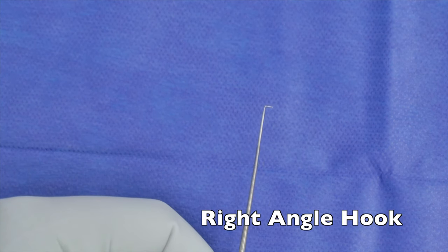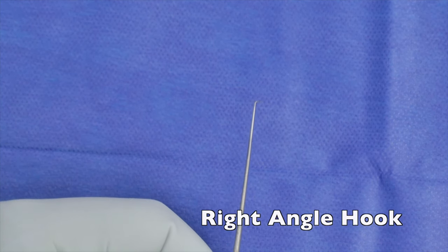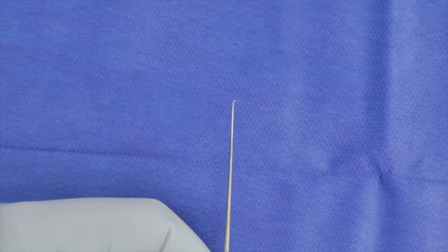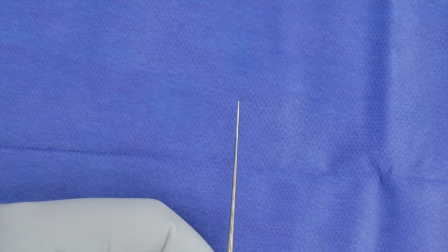Then we'll get into our right angles. There are many different sizes you can have for right-angle hooks: a 3mm, a 1.5mm, a 1mm, a 0.5mm, a 0.3mm. As you can see here, it's just what it says — it's a right angle. The tip tends to be sharp, and you can use that to work around angles, extract something from the middle ear, move the prosthesis around, et cetera.